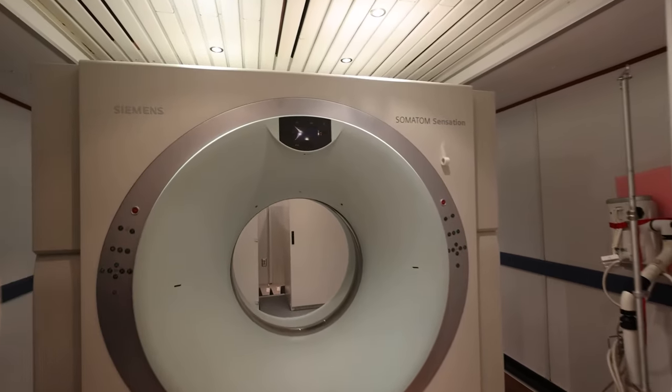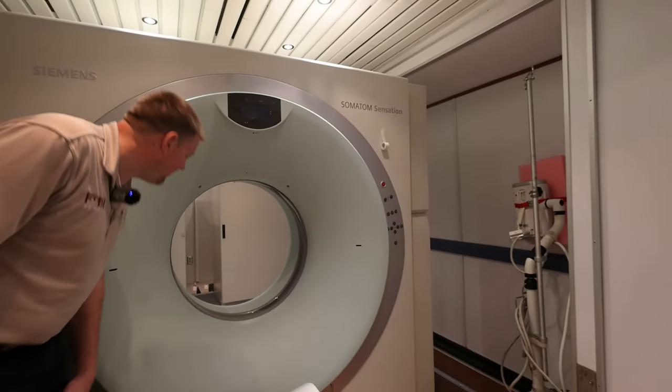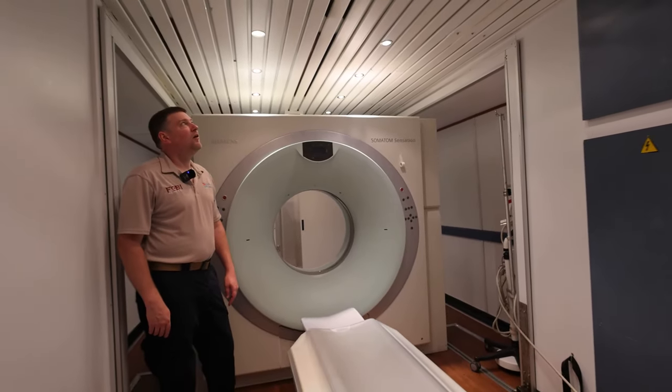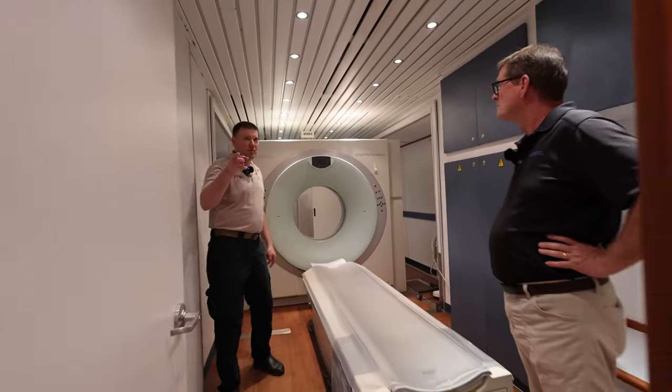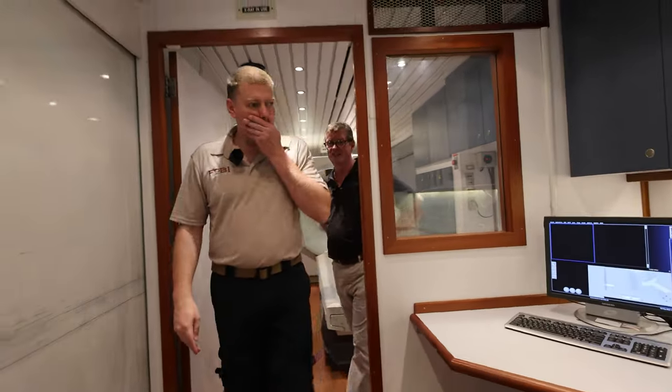Yeah, you got your injector, you got a portable sink, you got a generator cabinet in the back. Everything that you need. Changing room up front. That makes sense. So that's what that room is on this trailer? That's the changing room in this one? Yeah, all these trailers for some reason are just a little different. Different manufacturers set them up just a little differently.